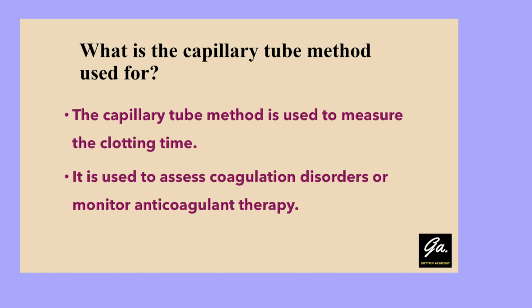Next question: what is the capillary tube method used for? The capillary tube method is used to measure the clotting time. It is used to assess coagulation disorders or monitor anticoagulant therapy.